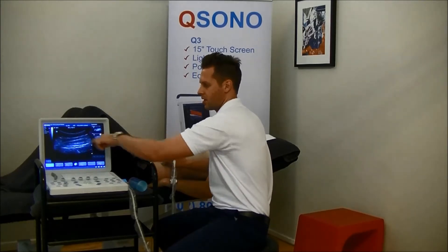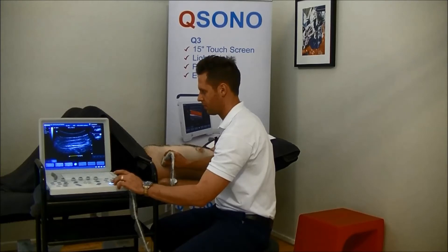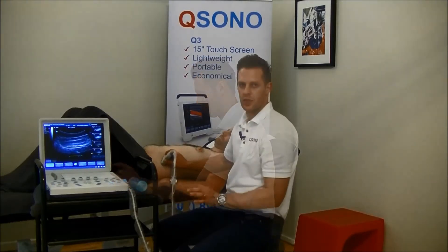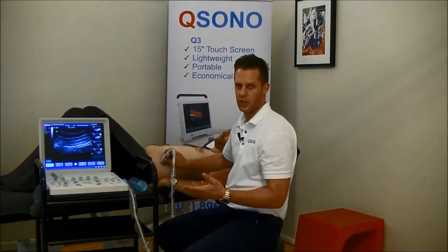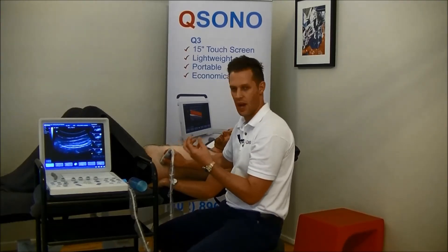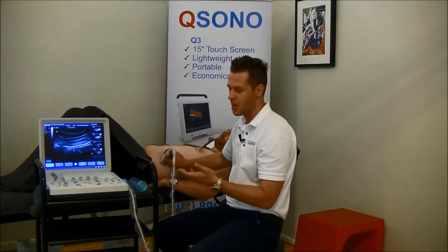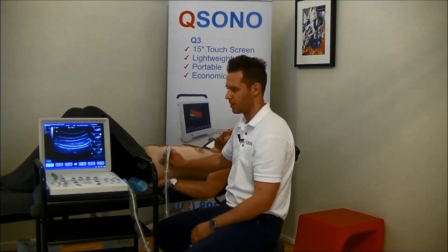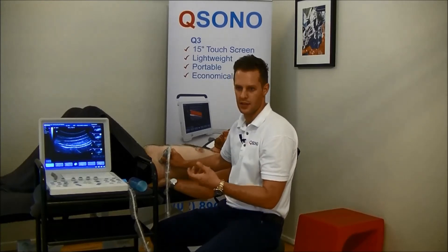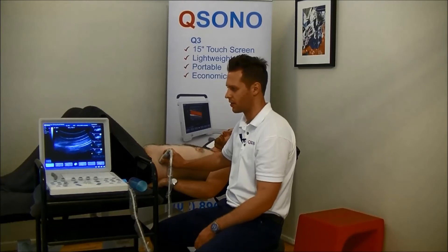And there we have a clearer image of the transverse abdominus at the bottom, internal oblique, and then above that external oblique. This layer at the top here is just subcutaneous fat. With transverse abdominus imaging, we're interested in two things: does the transverse abdominus thicken — are they able to do a contraction and does it contract when they do an active movement? And likewise for the internal oblique, does it thicken too much, and is it able to be relaxed or relatively relaxed compared to an overactive internal oblique?